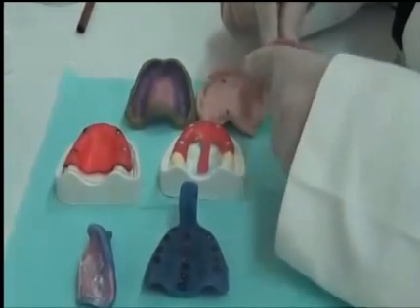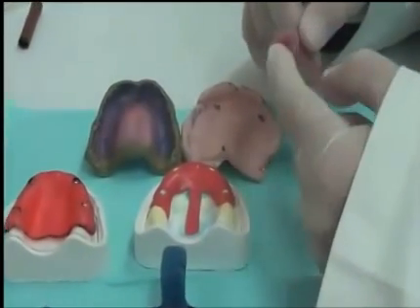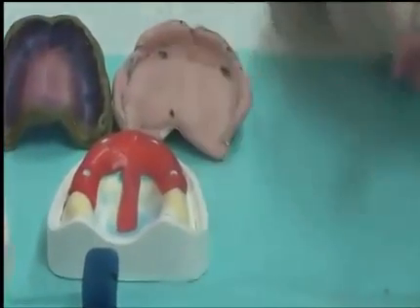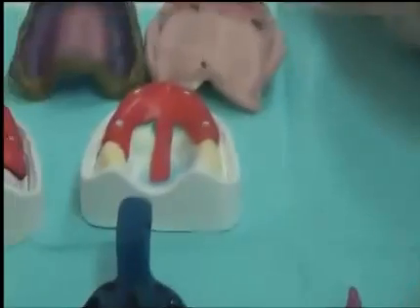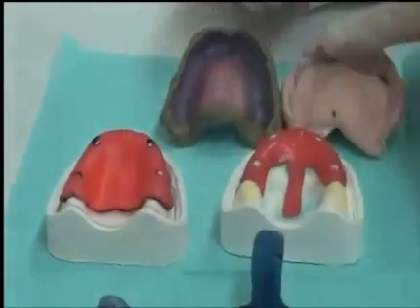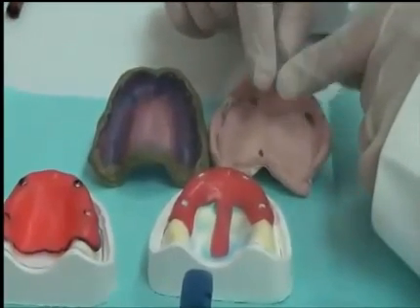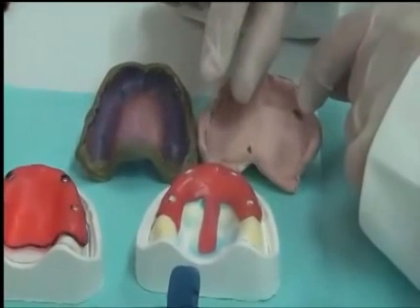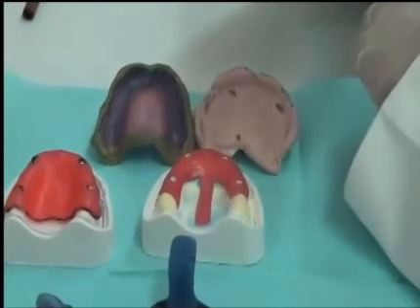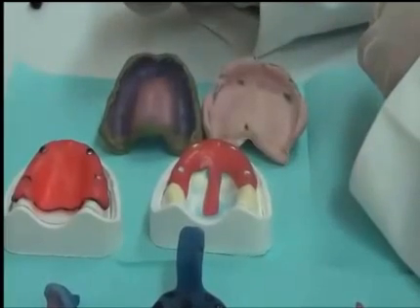we will put the zinc oxide eugenol, and this zinc oxide eugenol will be pressed between the tray and the tissue beneath firmly. That means all of the tissue is displaced. But in the cases where we have a spacer, once we remove this spacer, the impression material has sufficient space inside the areas where the wax was. This thickness of the material allows it to be mucostatic, meaning that it does not press the tissue away from its resting position. So you record the tissue at the resting position.